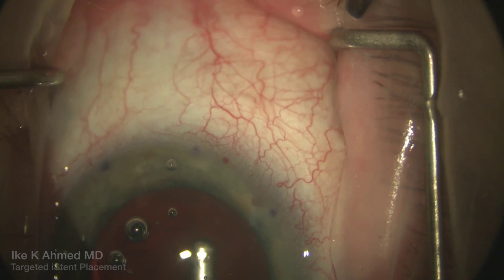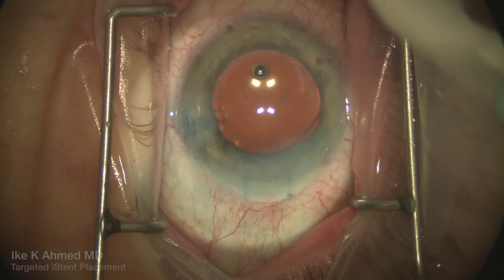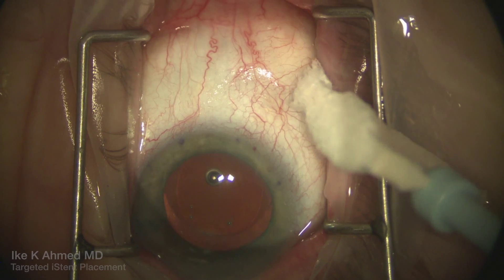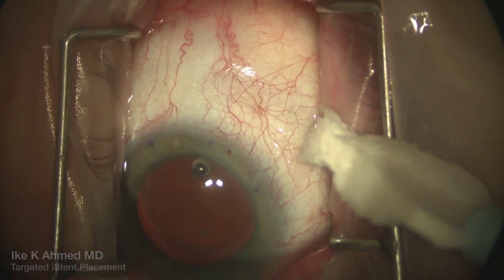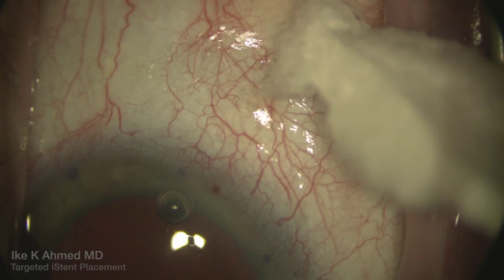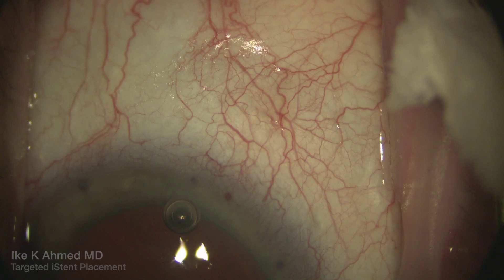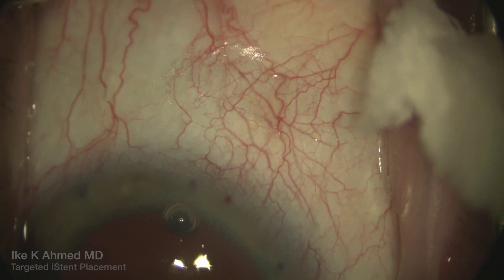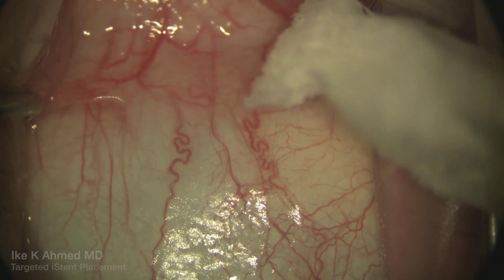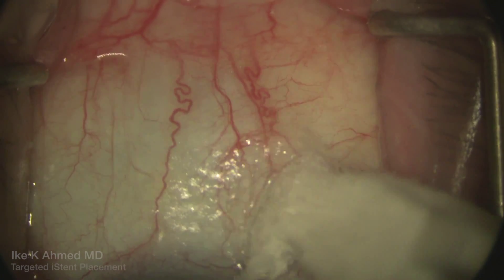Again showing the infranasal, nasal, and supranasal quadrants very nicely demonstrating the passage of aqueous. We've now removed the irrigation handpiece, resulting in an IOP of around 20 mmHg. In this now somewhat physiologic state without any irrigation in the eye, we see pulsatile flow occurring amongst these episcleral veins, with a similar distribution to what we identified preoperatively in terms of location with the aqueous veins that emerged supranasally.